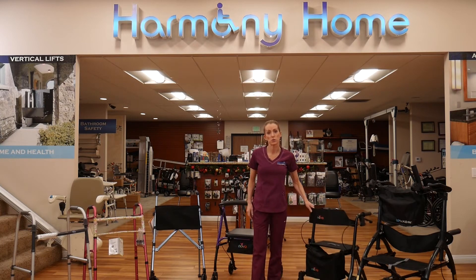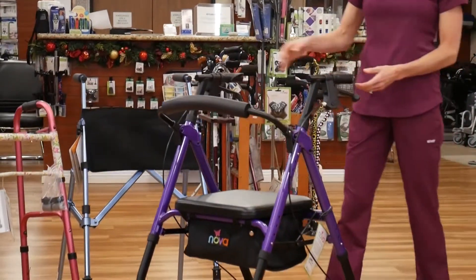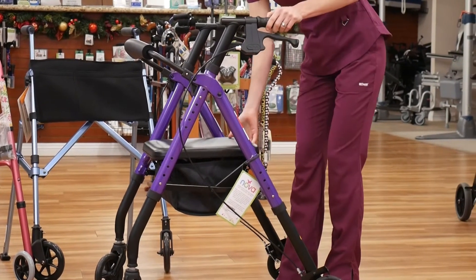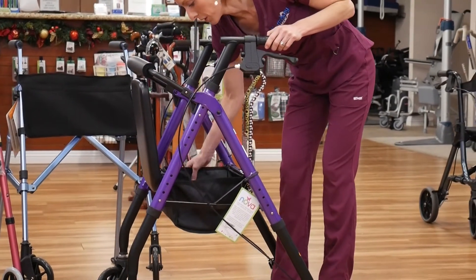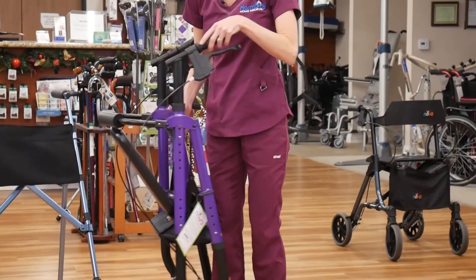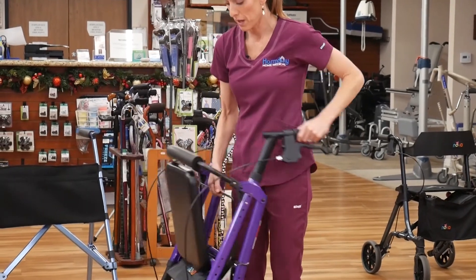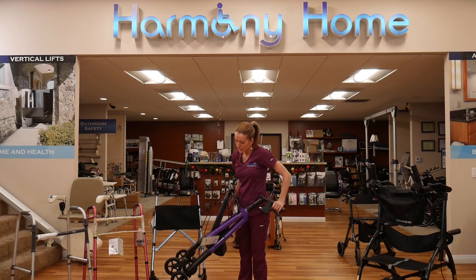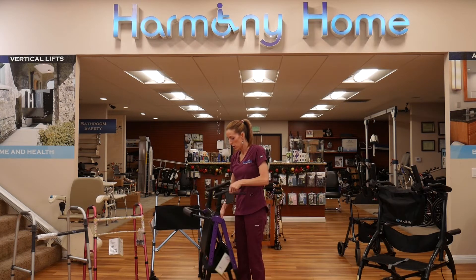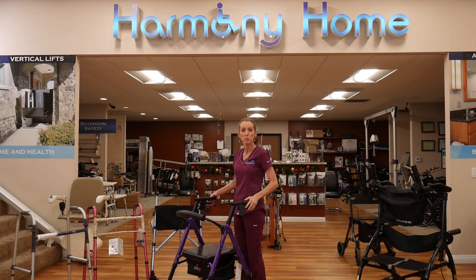There's a small distinction between a Euro rollator and a traditional one, and that's just in how it folds. We size it the same and use the brakes the same. When we go to fold it, we flip up the seat and pull in the middle. They all have a handle somewhere inside the basket or on the bar, and you pull that to fold it, then you can put it into your car. It's still a small, compact unit. The seats tend to move around a little bit, so it's not quite as easy to keep together as a Euro style, but it serves the same purpose and can help you be on your way.